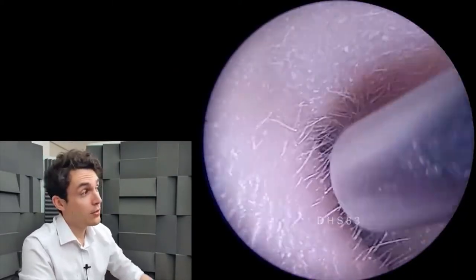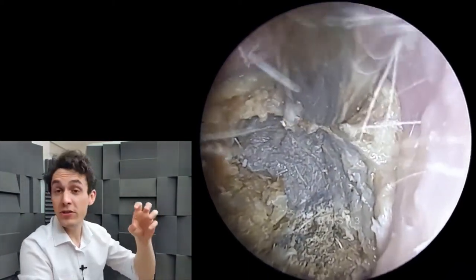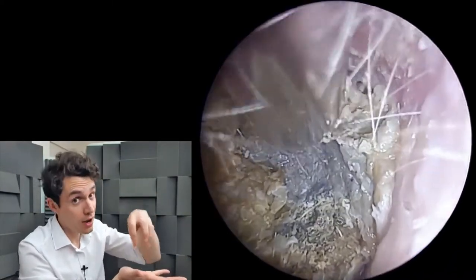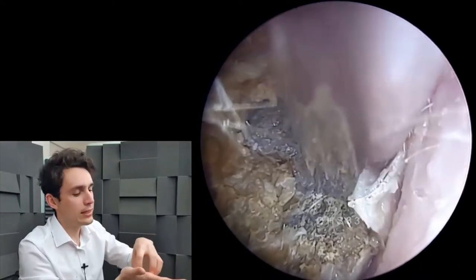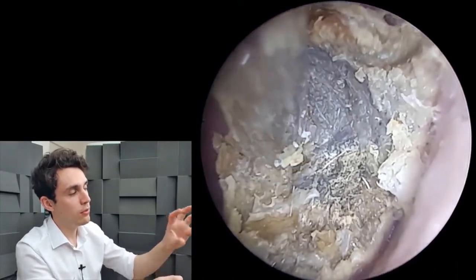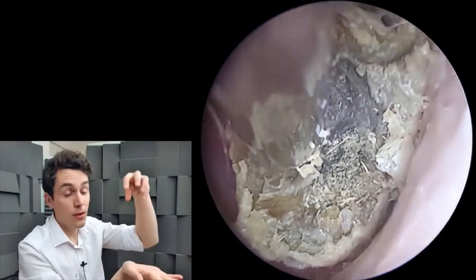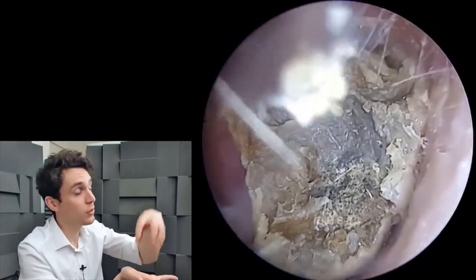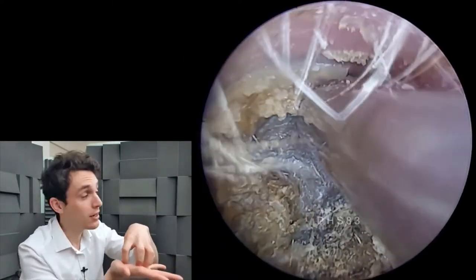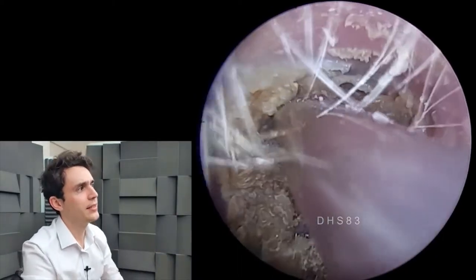The incumbent problem with that is not only is it adhered to the canal walls, but when you have a rigid steel suction probe and you're trying to latch on to a very uneven, dry, hard, crusty surface, you tend not to get that seal. In suction videos, whenever I'm approaching a boulder of wax or soft wax, we can usually drag it out because a seal — an interface, a coupling — is created between the steel suction probe and the wax. The two surfaces essentially meet and create an airtight lock which allows us to drag it out, and in this particular case that is just not happening.